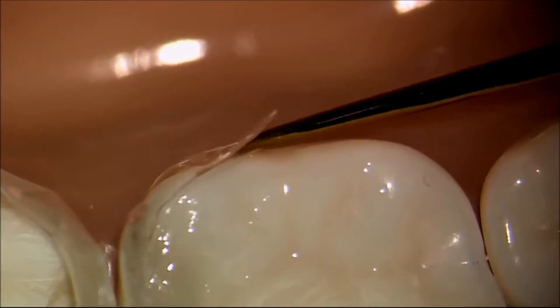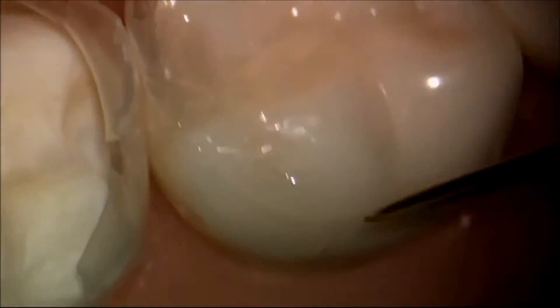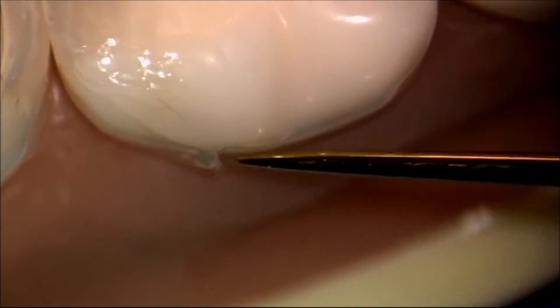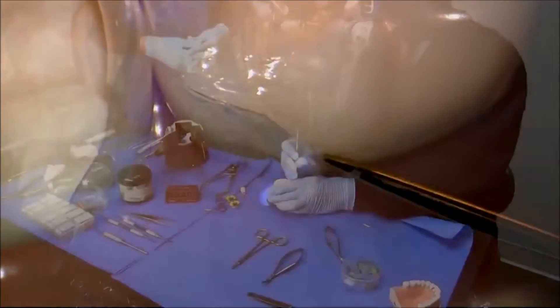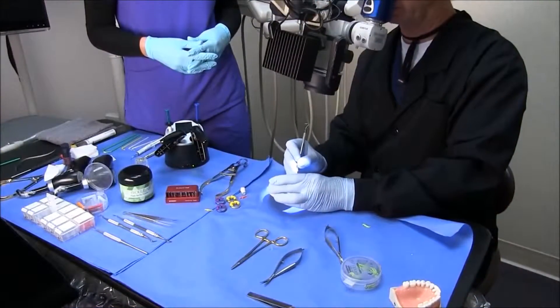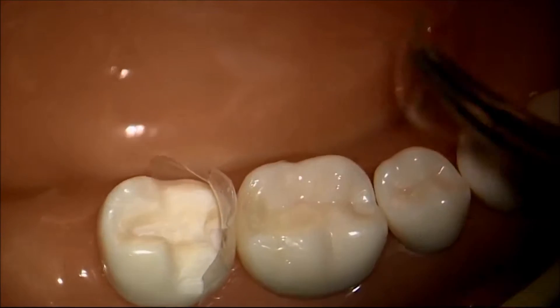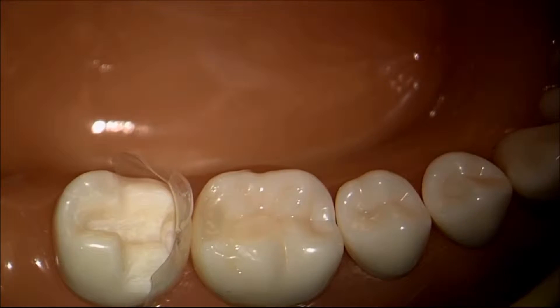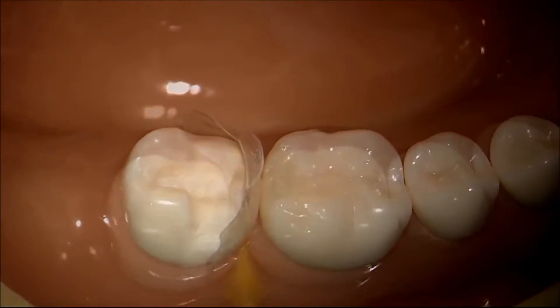Something to keep in mind is that the buccal matrix was built with a quick release. You can see the matrix is pulled away just a little bit, making it very easy to get purchase on the matrix and tease it away from the tooth. Compared to metal matrices, the buccal matrix — because it's so much smoother — releases more easily from both the tooth and the composite.